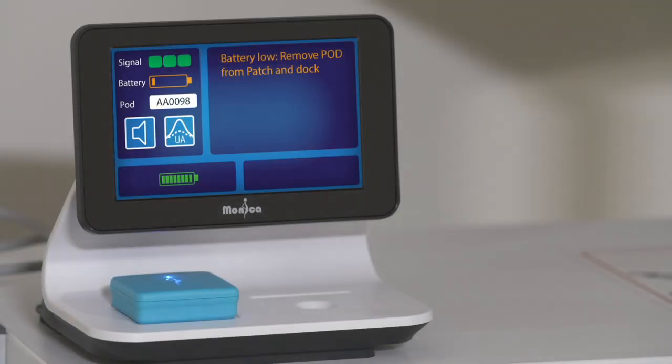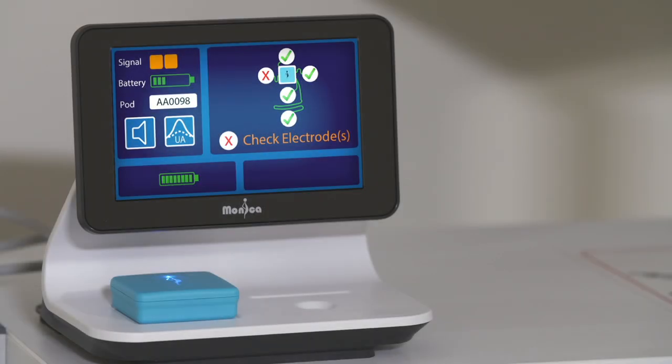Battery low: a fully charged pod has a battery life of up to 11 hours. When the battery drops to around 60 minutes remaining, the battery low message will be displayed along with an audio alert. This can be silenced by pressing the audio on/off icon. If the pod is not replaced, it will alert again after 15 minutes. Electrode disconnection: the pod will know if one or more electrodes have become detached.